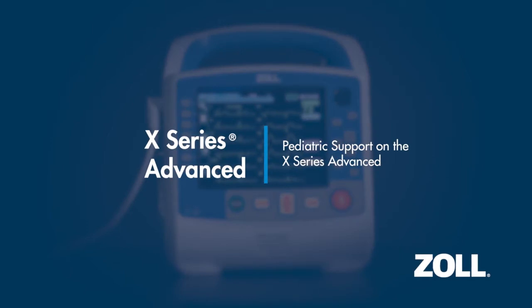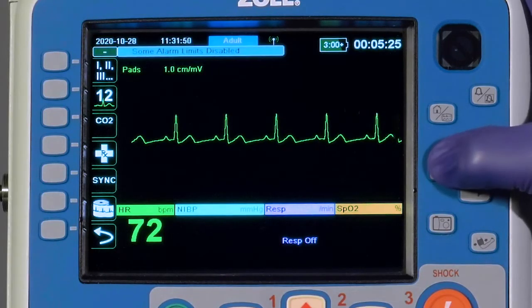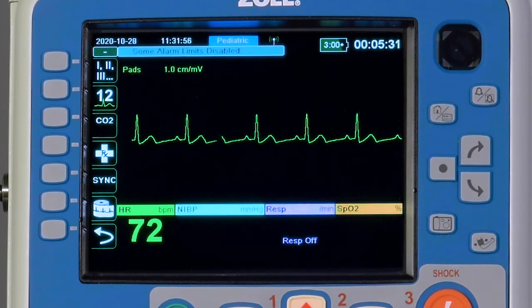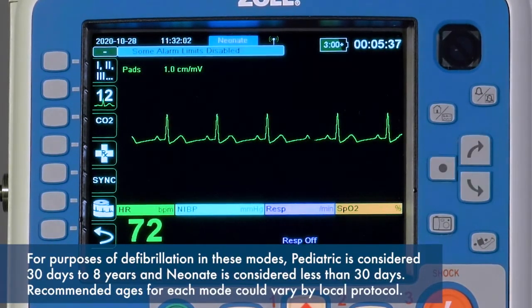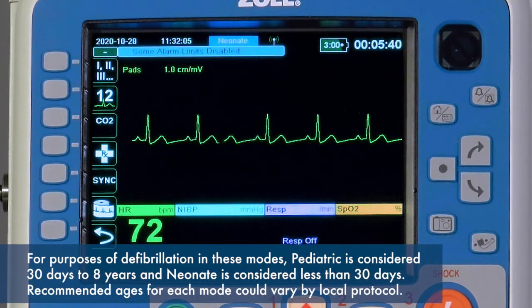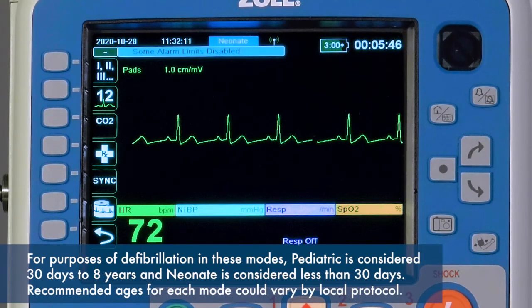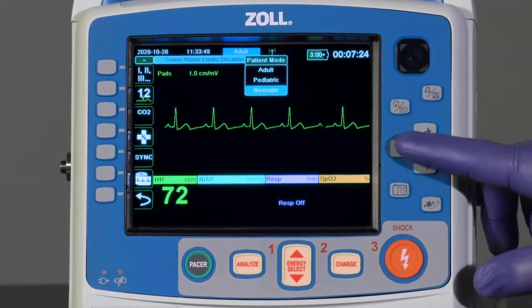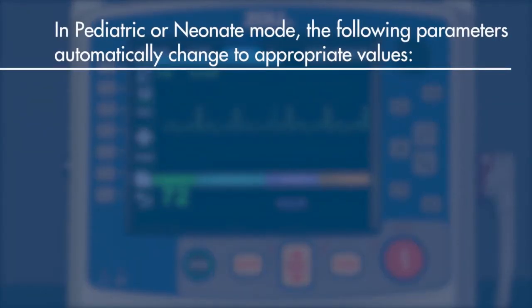Pediatric support on the X-Series Advanced: by placing the X-Series Advanced into pediatric or neonate mode, the device reconfigures multiple parameters specifically to either age group. For purposes of defibrillation, in these modes pediatric is considered 30 days to eight years and neonate is considered less than 30 days. Recommended ages for each mode could vary by local protocol.